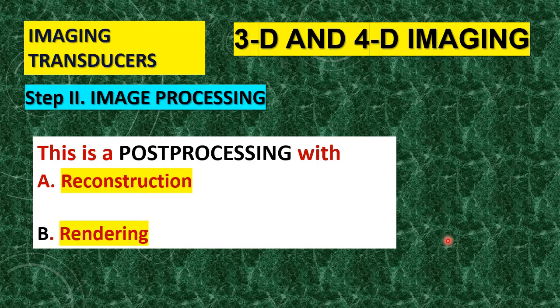So this step is taken in two steps actually. The image processing is divided into two steps. First one is reconstruction, and as I told you here, we have something called a pre-formed or pre-prepared grid of voxels. So they are empty spaces that are in cubes, very small, very minute cubes. This is like an already built grid inside the electronics, and what you scan will be filling this grid. So this is reconstruction. By this step, what happened?